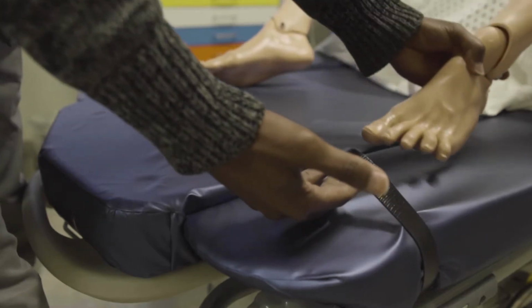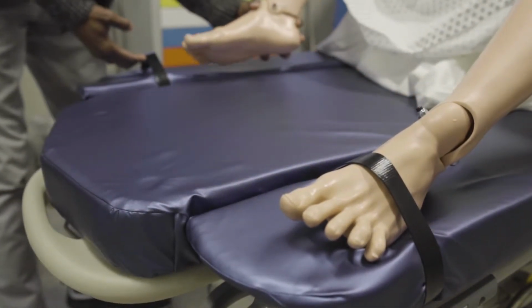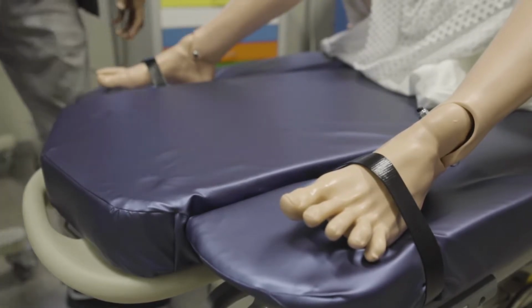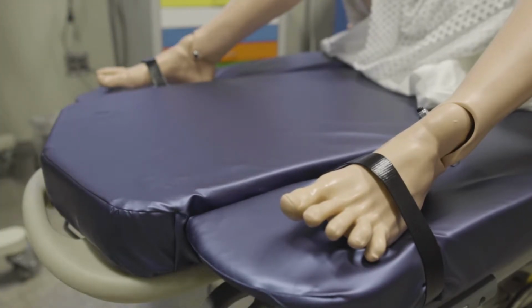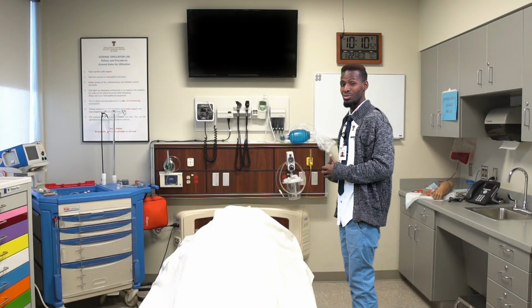This stretcher also has straps to help keep the patient's feet secured. To use them, just lift the strap and slide the patient's foot underneath. And that is how you properly use the OBGYN stretcher.